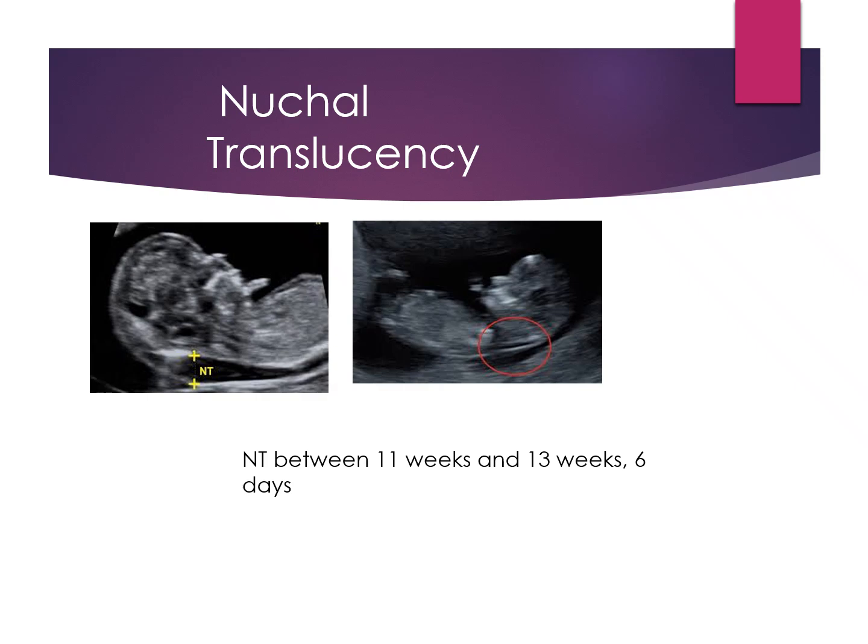So you have to send in several images and get a special certification in order to do an NT scan. And it's because it holds a lot of weight. This is like a marker for trisomies and chromosomal abnormalities. So they really want to make sure that we're not over measuring it or making some crazy thing up. You really have to know what you're doing with it.